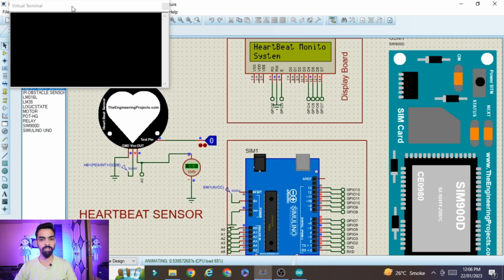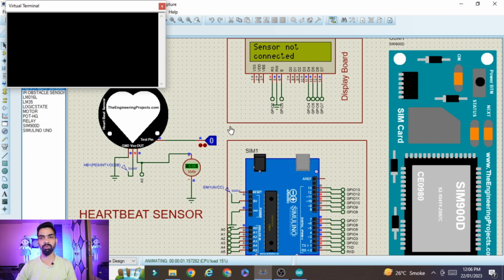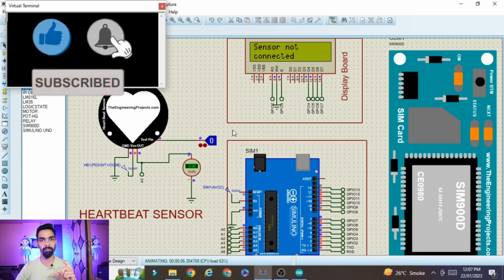Now let's see the practical demonstration of this project. Now you can see once we start the project, then you will see sensor not connected on the LCD because we haven't given the one signal to the heartbeat sensor. So once we give the one signal to this heartbeat sensor, then the heartbeat sensor starts sending high or low pulses. If the Arduino detects a high pulse, then Arduino will count that heartbeat as 10. If the Arduino detects two high pulses, then Arduino will count the heartbeat as 20. So within 10 seconds, if the Arduino detects 4 high pulses, then at the end you will get the heartbeat as 40. If the Arduino detects 7 high pulses within 10 seconds, then you will get the count as 70. So why is this multiplied by 10?